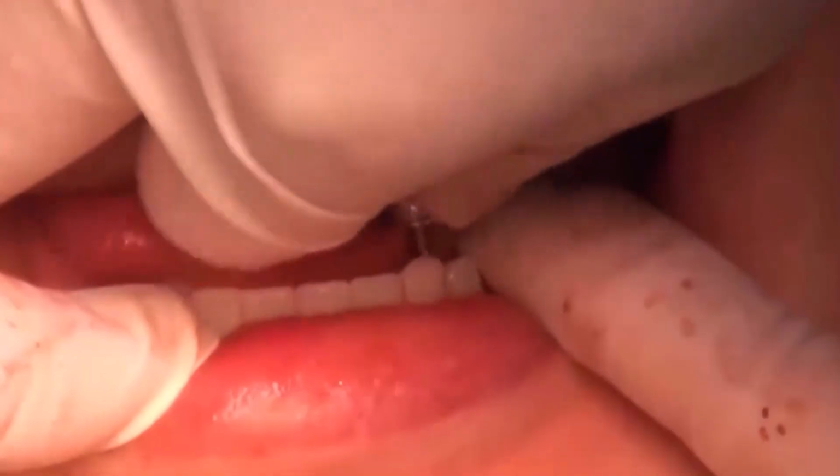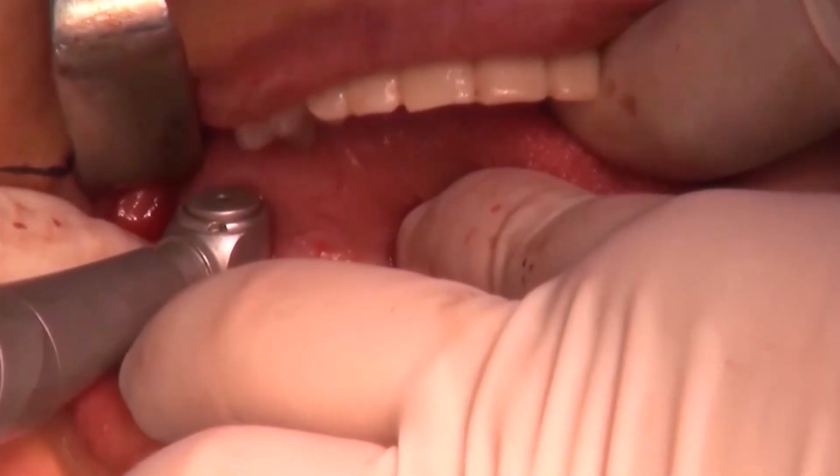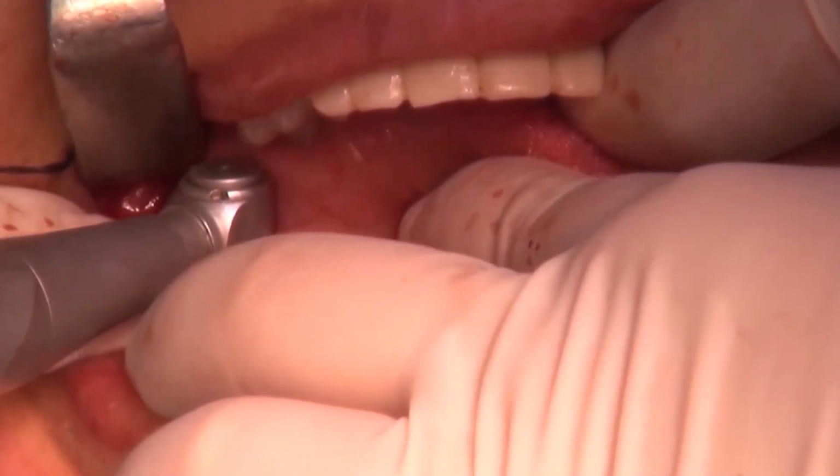After polymerizing the resin, the provisional denture is removed by unscrewing the screws.